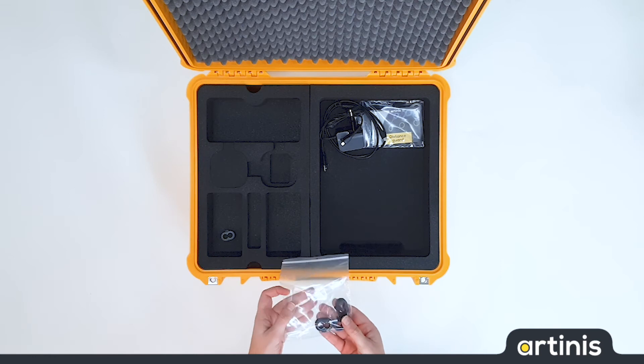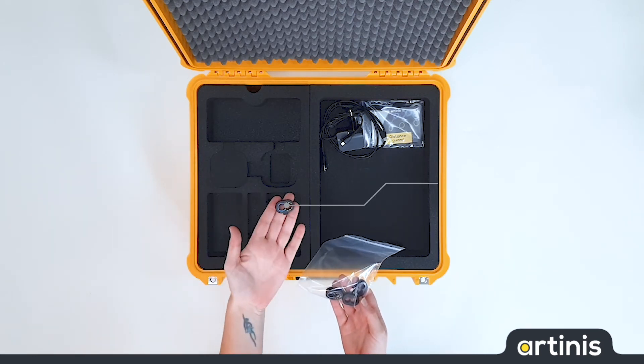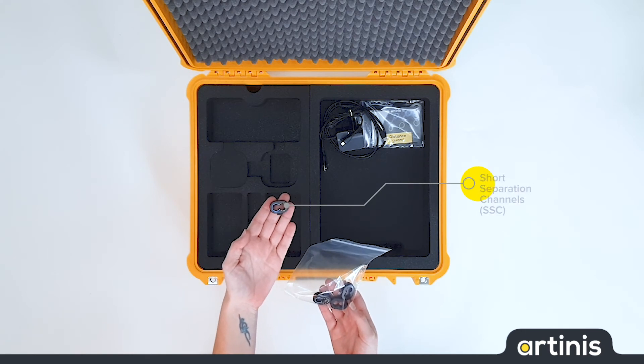With the Brite MK2 it is possible to make short separation channels. The optode holder like this is especially designed for those short channels.